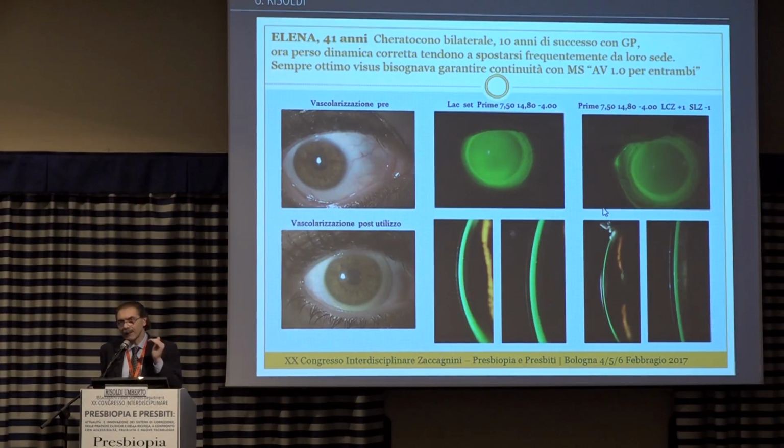We have used 100 microns and did something about the SLZ as well, because there was some movement, some motion, and infiltrations under the lens.